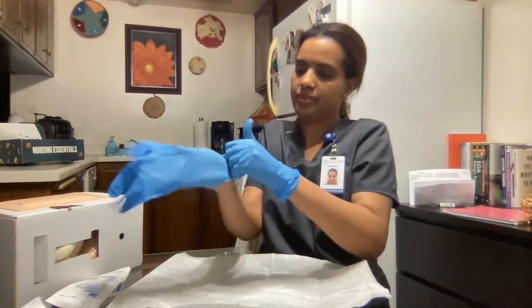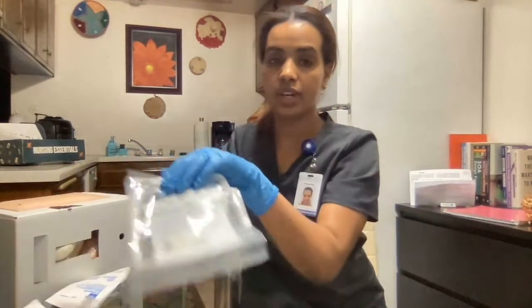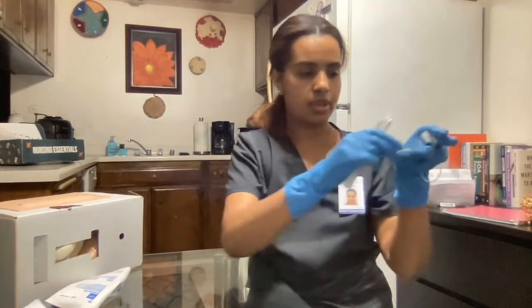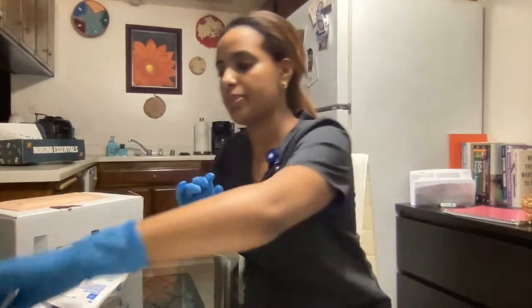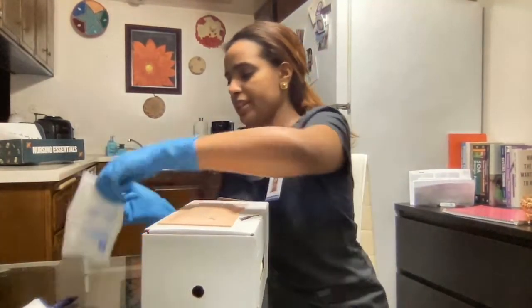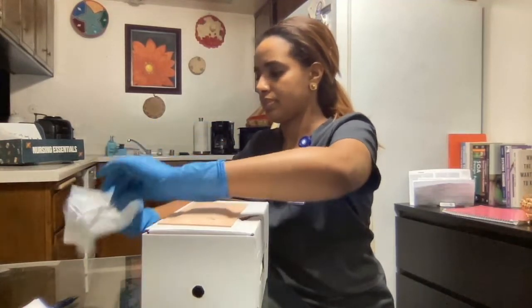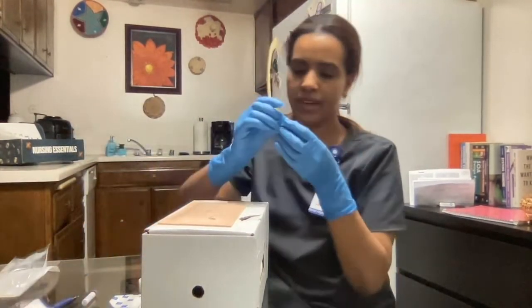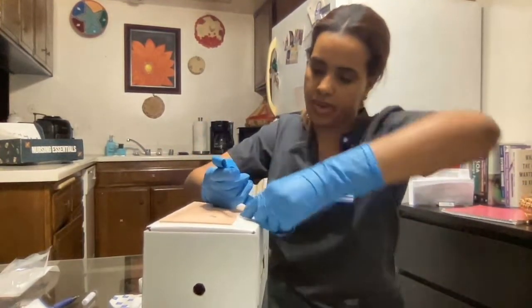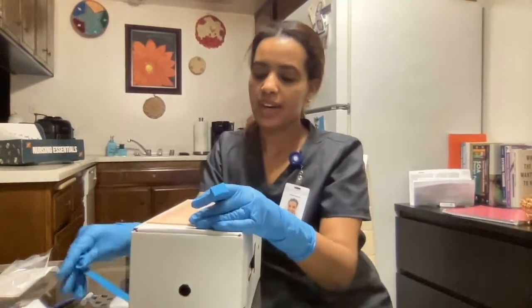The first thing I will do is go ahead and wear my sterile gloves — try not to touch the inside part. I also want to mention that I have my sharps container here and my trash over there.